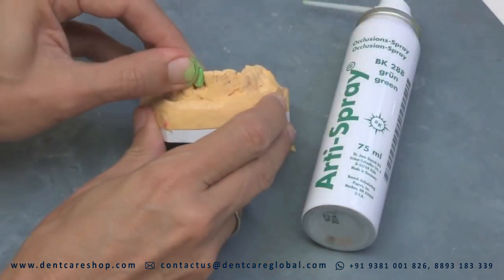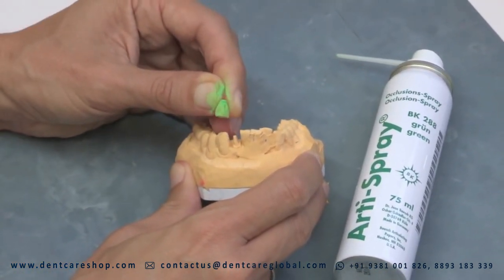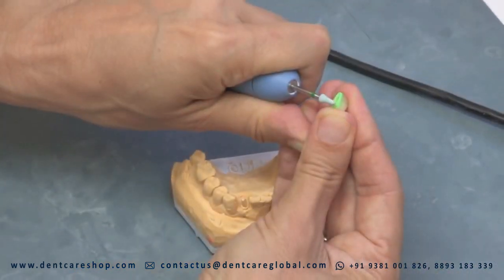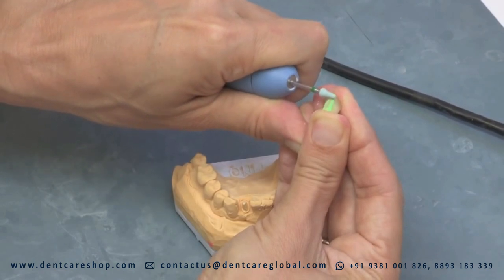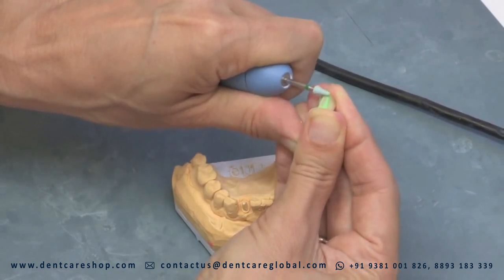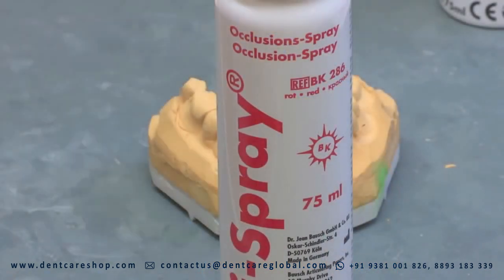Adi Spray can be used for approximal contacts when trial seating crowns and bridges. Adi Spray contains physiologically safe ingredients and is filled with environmentally neutral propellants, and meets the requirements of the European Council Directive 93-42-EEC for medical devices.